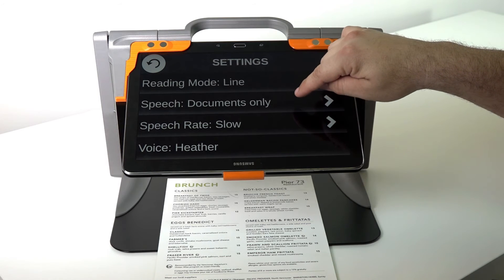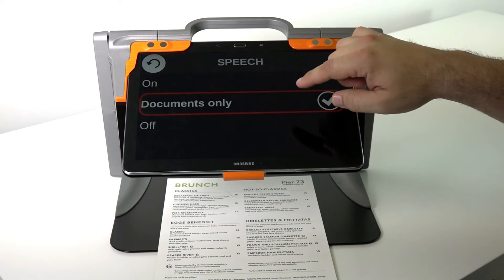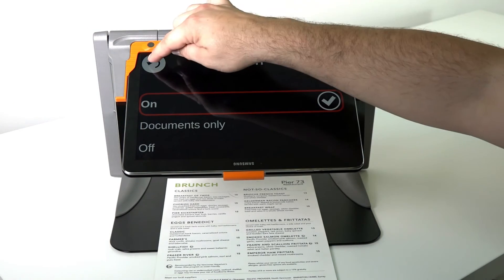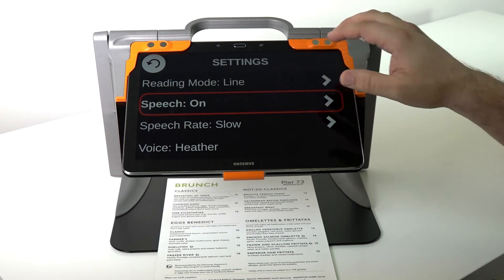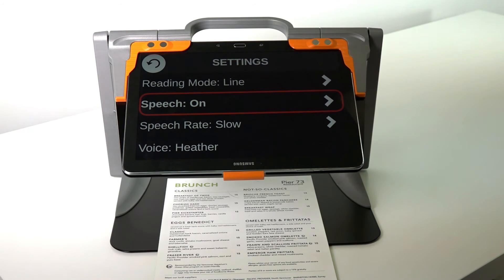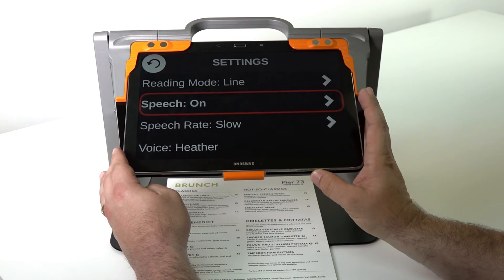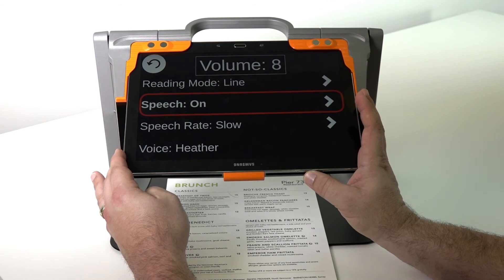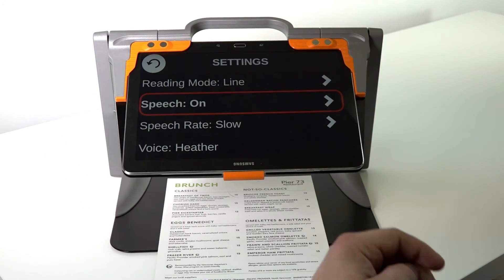Remember that with Prodigy Connect you can activate voice in the settings under speech. At this time it's documents only, but if I put the speech on, then my interface becomes fully accessible for someone that cannot read the items on the screen. Speech can be heard anywhere in the menus or on the document, and the volume can be adjusted using the volume buttons on the bottom right side.